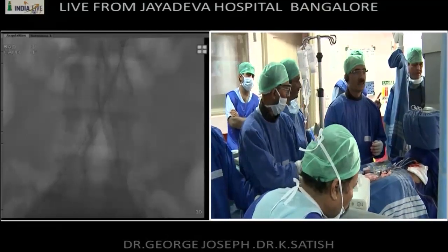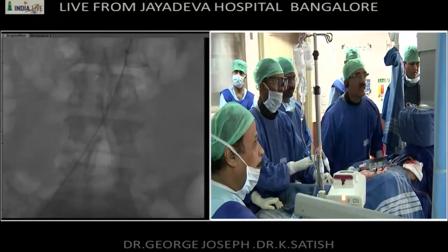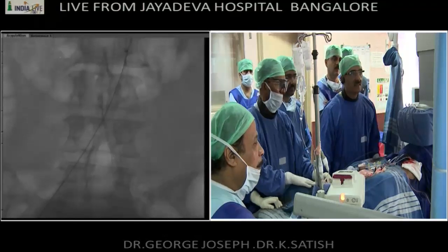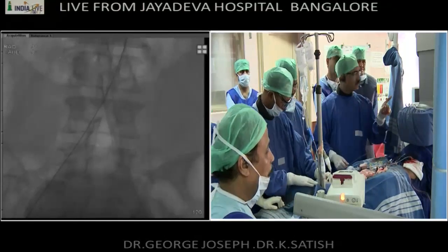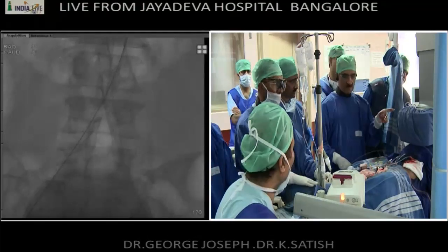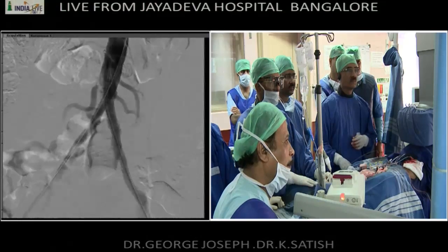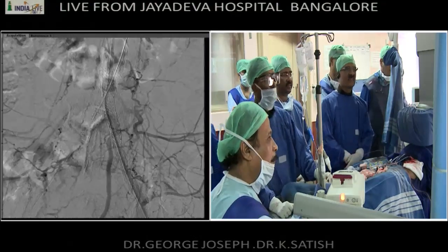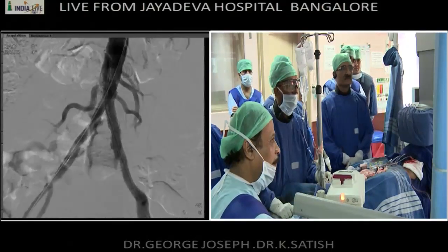Yeah, but many a times the aorta is a millimeter bigger than 14. No, that's okay. No, but a 14 millimeter stent going into the lower iliac will be too big. Over a period of time, it will expand. Hold breath. But many a times the aorta is bigger than 14. I think the lower aorta is bigger than 14 in this case, so 14 would not suffice.